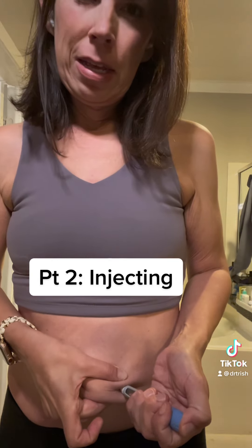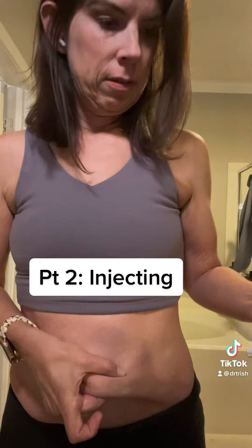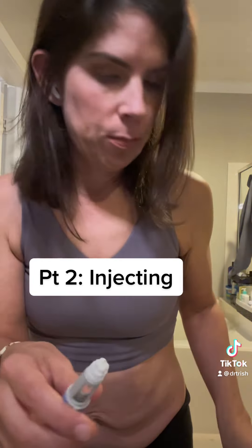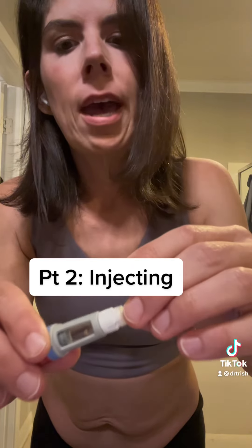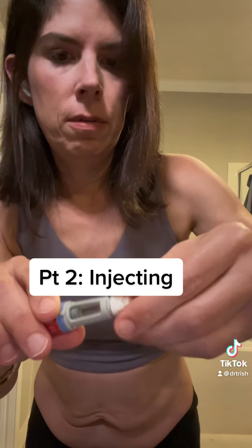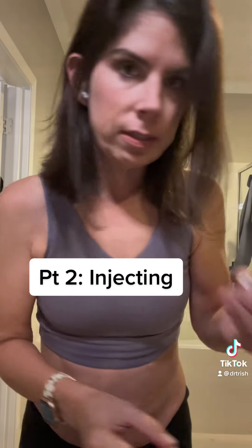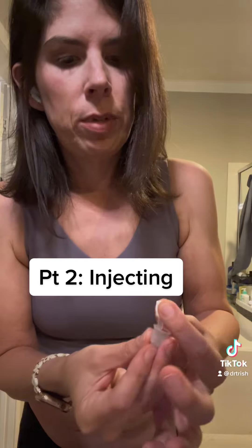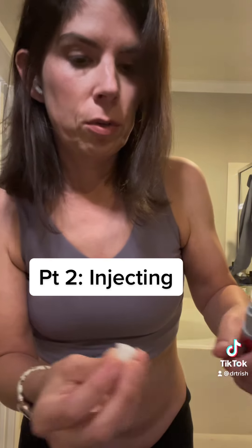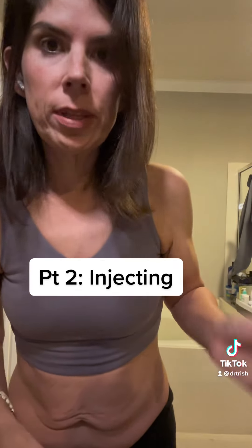For this Ozempic pen, I'm just going to pinch my skin. The needle is so small I can barely feel it. Medicine is in — take it out, and that's done. Now put the cap back on: twist off carefully — that's the needle on the inside — and put the outer cap back on.